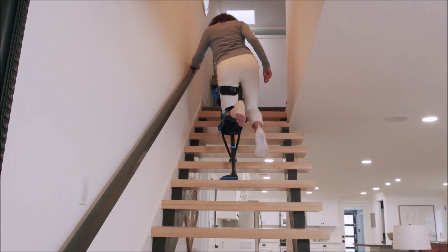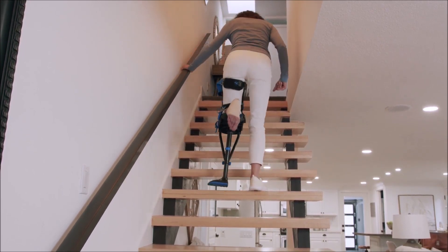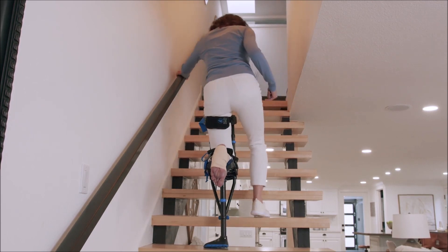The recommended way to descend the stairs is to go down backwards. Start with your iWALK leg, followed by your good leg. Continue to descend one step at a time.